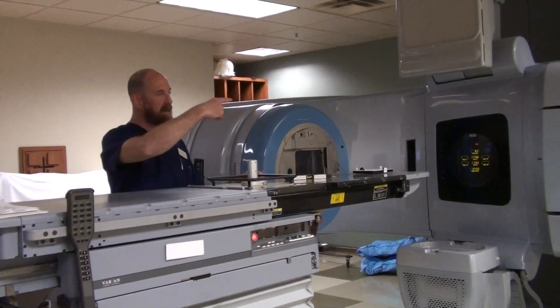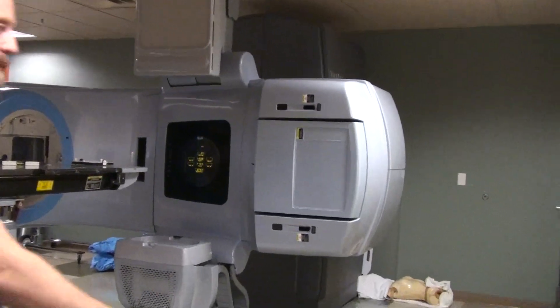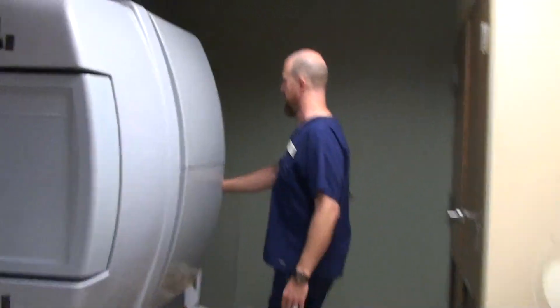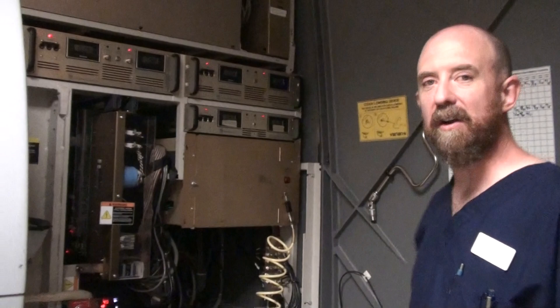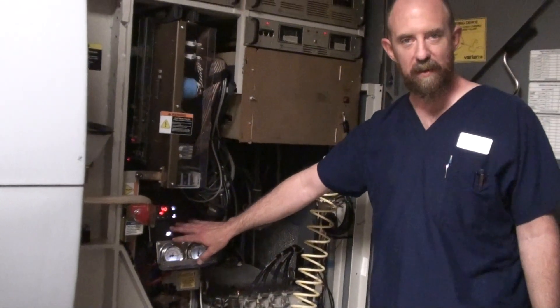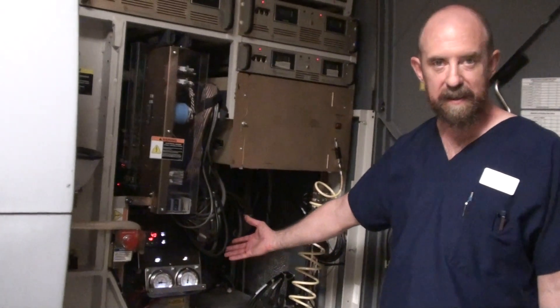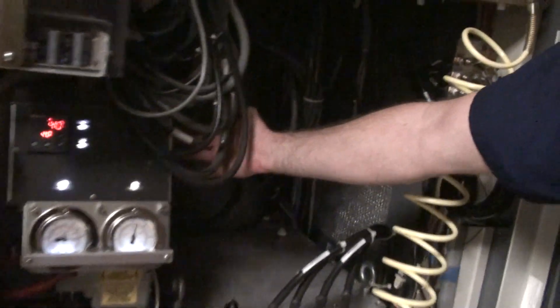The last thing you need to check is inside the gantry stand. Just like checking the oil and the water in your car, we want to make sure that the water level on the machine is correct and that our gas pressures are correct. There's a certain tolerance that your system pressures, gas pressures, water temperature, and water level should be. In this particular unit, it all takes place right here. There's a little dipstick over here with a little red floaty — that tells you the water level.